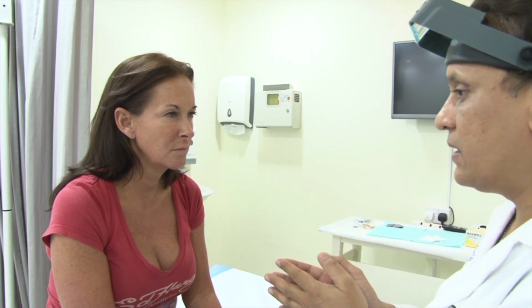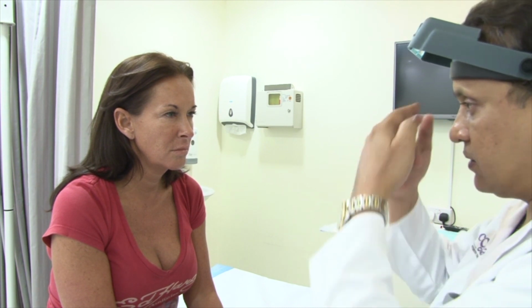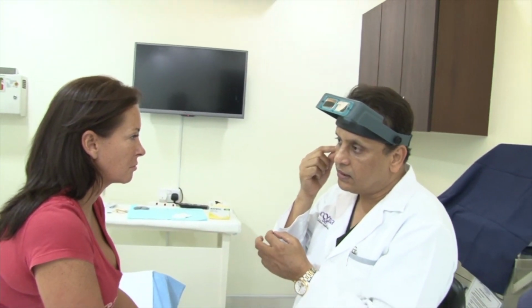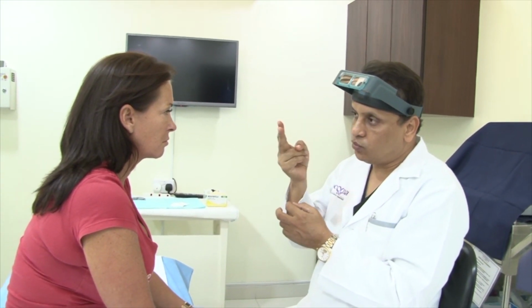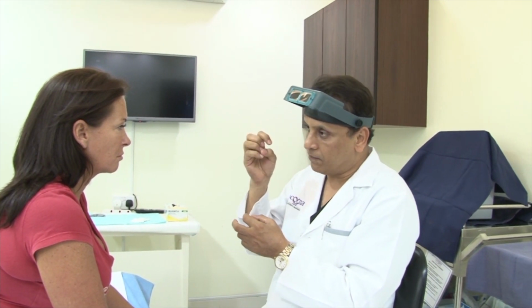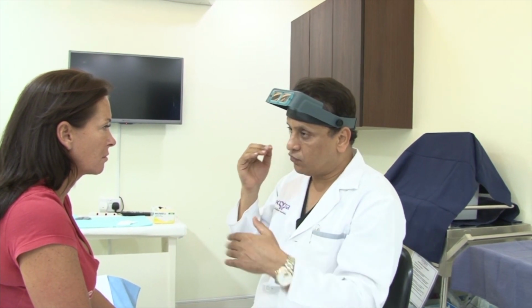And what's the process for that? Fraxel laser takes about a 20-25 minute treatment. It's done for the whole face. You apply some numbing cream like you did now, okay? And the laser is like a shower of dots of laser. So it's like tuck tuck tuck tuck. So it does two benefits. One is, since it penetrates deeper, it contracts the skin and stimulates the collagen. Second thing is it peels the skin in the next 4-5 days.